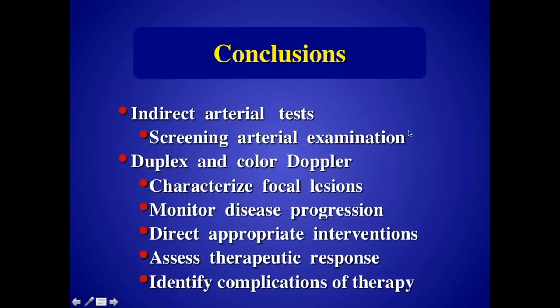We've got one question. Okay, I see only part of the question. Okay. Oh, here it is. Can the waveform of the carotid give us insight to a dissection of the proximal aorta?